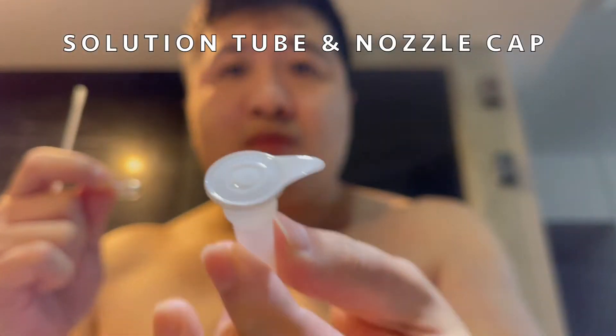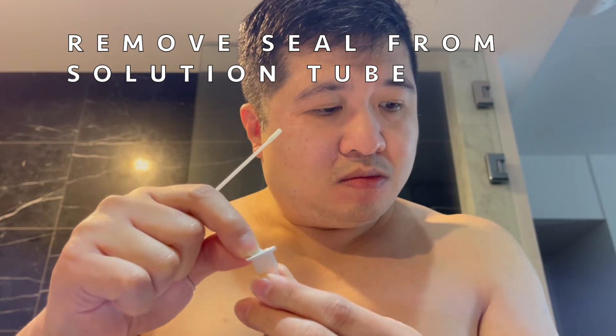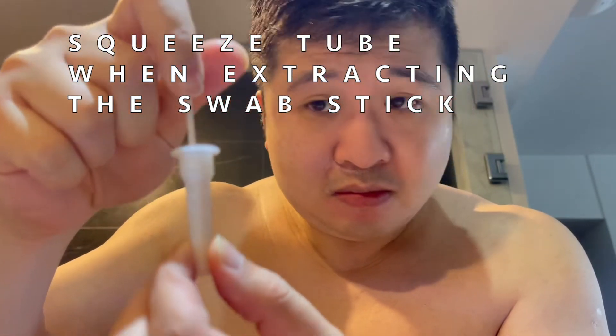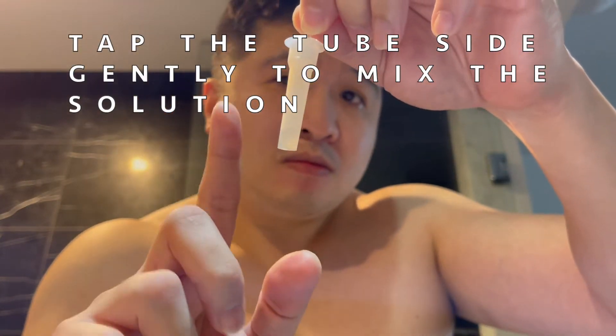This is again the solution tube and nozzle cap. Remove seal from solution tube. Insert swab stick and stir more than 10 times in the solution. Squeeze tube when extracting the swab stick. Press the nozzle cap tightly onto the tube. Tap the tube side gently to mix the solution.